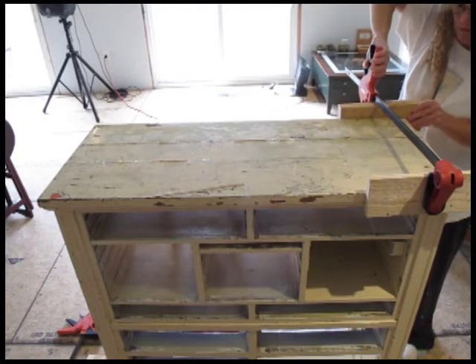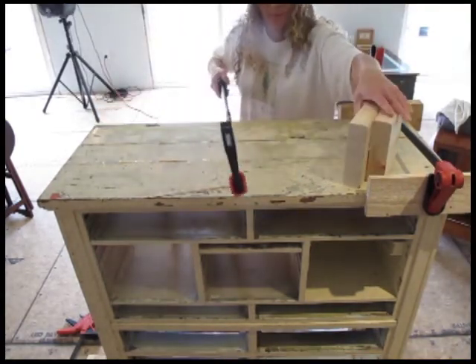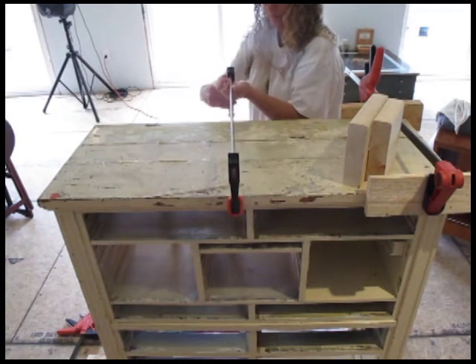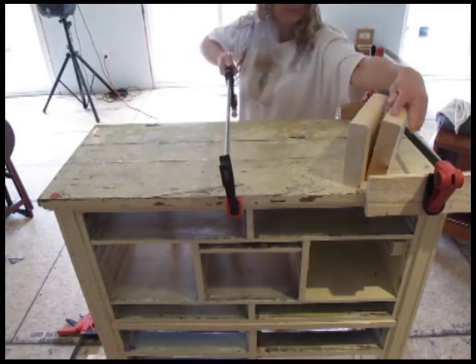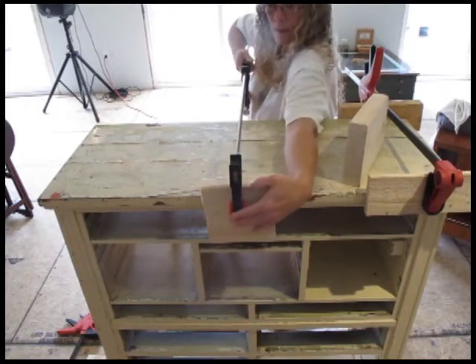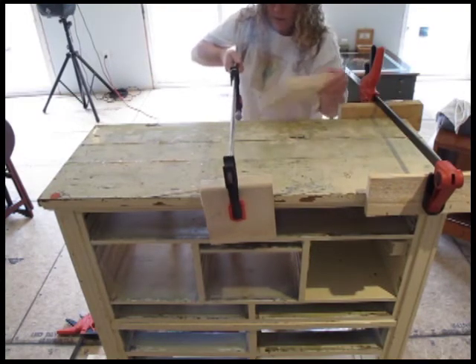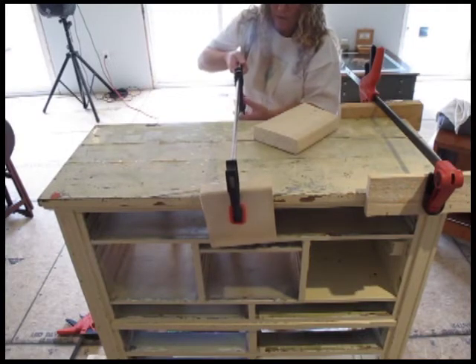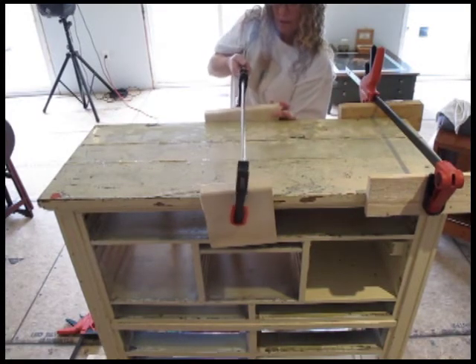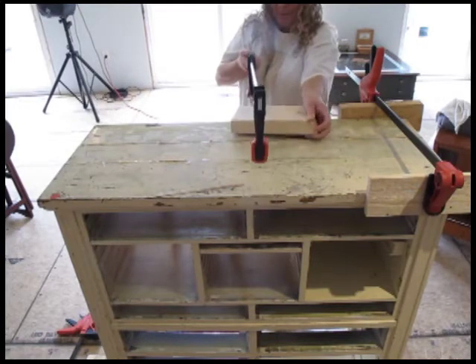I'm gonna scoop down there. Oh, there's one in this one. I got one. Okay, now number 2. How do you do this one? This one, I'm just going to slide to there. And then this side, I'm going to slide to there. And now I'm going to keep my hands in frustration.